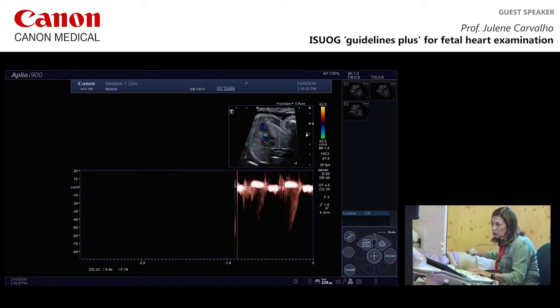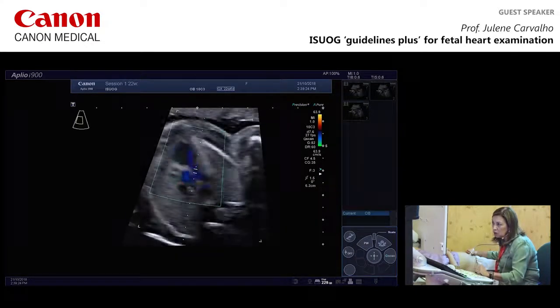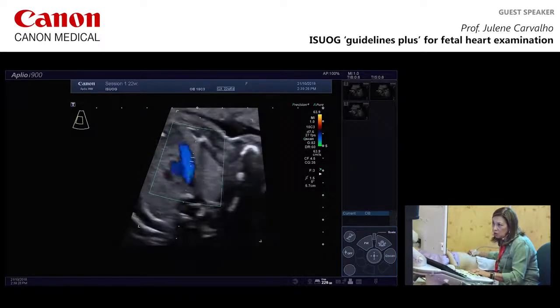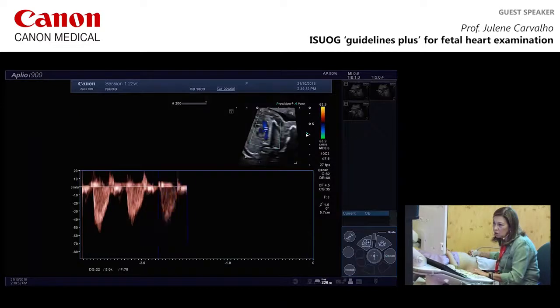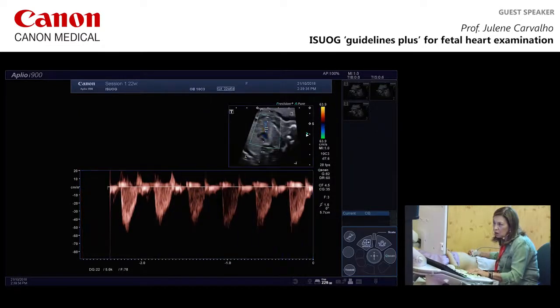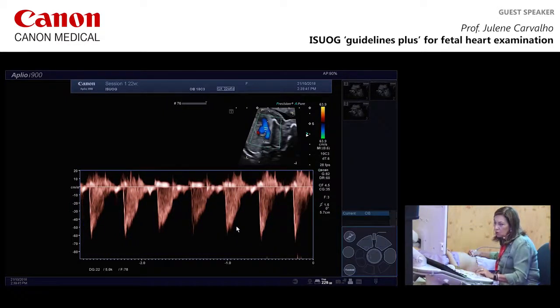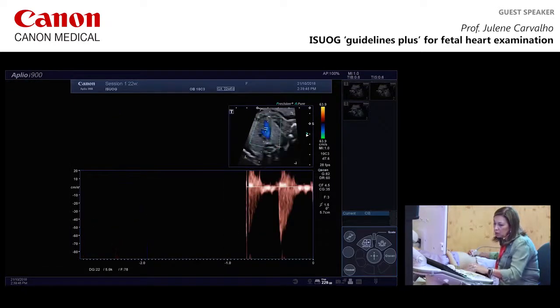Back into live, so already here in the pulmonary artery, so come out of that so you can see the image. Again, I'm going to adjust my hand a little bit more to be parallel to the pulmonary artery. Slightly lower velocity in the pulmonary artery. So it's around 60.